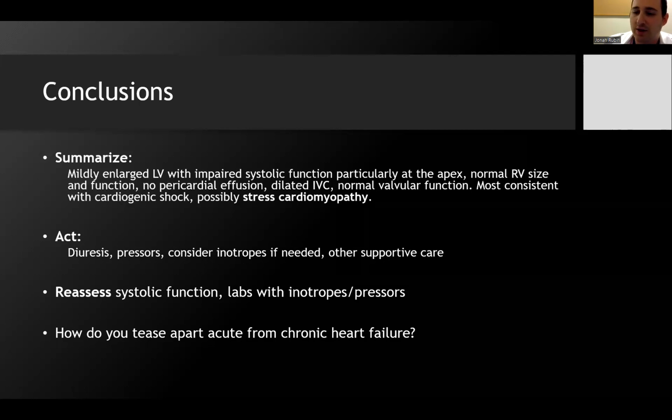You can also look at your VTI for cardiac output, because if this is a patient who has a compensated decreased EF, then their stroke volume and cardiac output should be normal, and their shock might be from something else. If their stroke volume is terrible, then it's probably or possibly also still related to their heart failure. So lots of things to think about.